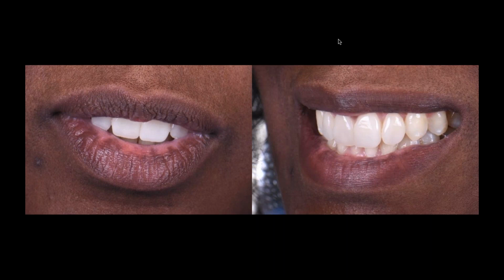Okay, so yes, the things that we gotta pay a lot of attention always is the soft tissues, how gentle we are when we place the first cord, and if we need to place a second retraction cord, not leave it more than necessary, because we are not sure which of those biotypes are going to have an irreversible recession.